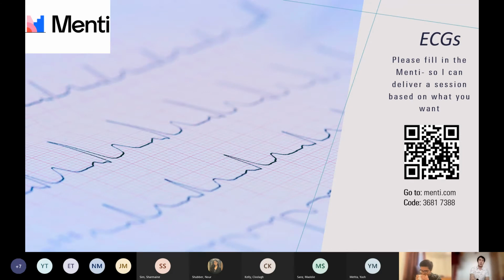I suppose this is a really important topic because it comes up quite a lot, but also it's a very useful core skill to you all as F1s. I think I've had conversations with this before with Anush, and I agree with him actually, that a lot of ECGs for exams can be pattern recognition. But what I hope to cover today will take you beyond the pattern recognition, because whilst it might be good for SBAs, it certainly isn't good for when you're on the wards and when you're the F1 in A&E and you have to actually analyse the ECG.